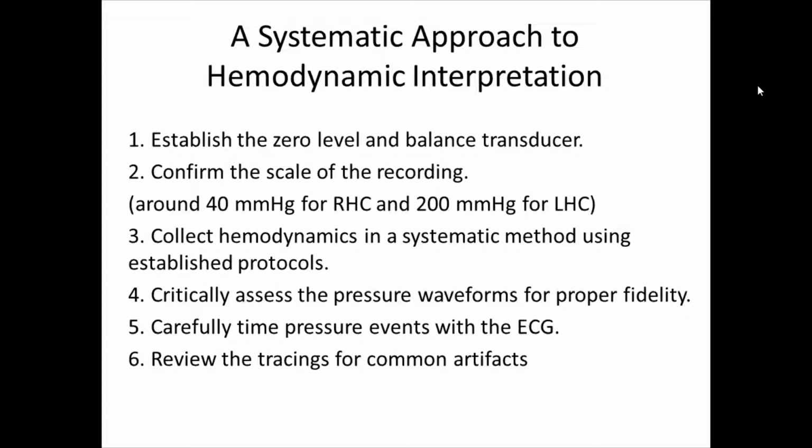This depends on the question from the study, and you have to assess the pressure waveforms. We are going to go through the waveforms of different hemodynamics and of different chambers and vessels. It is important to time your hemodynamic pressure waves with an ECG so you can know the systole and diastole. Also, you have to review for artifacts, and you have to have an idea about the common artifacts in hemodynamic tracing.